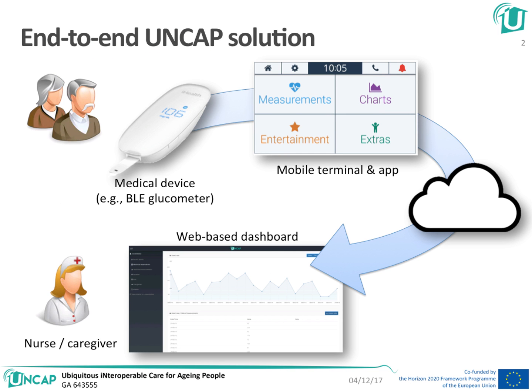Now, the Uncap Box and the Uncap Web app represent two important pieces of the end-to-end Uncap solution. Uncap interconnects on one side the elderly, and on the other side a caregiver or a medical professional. A scenario of how this could be used is seen in the picture.